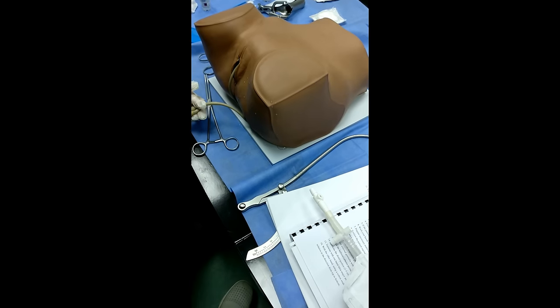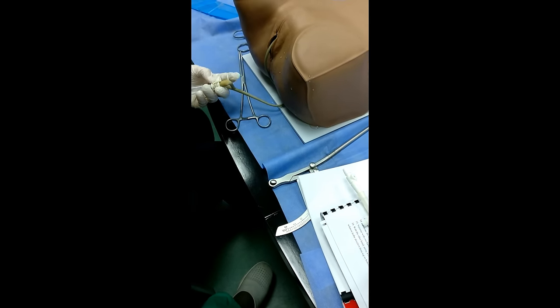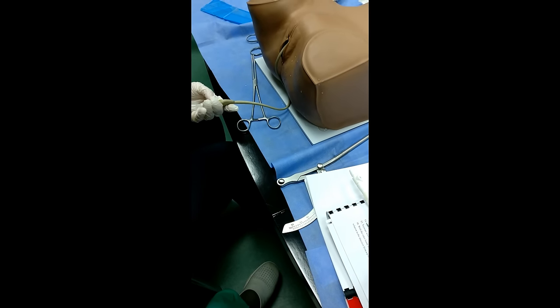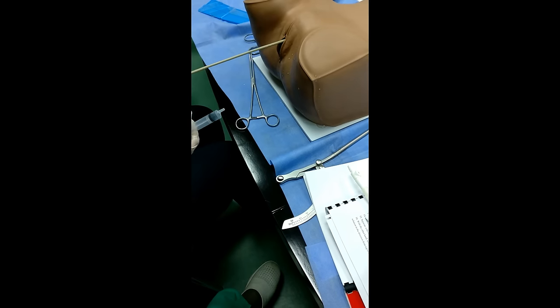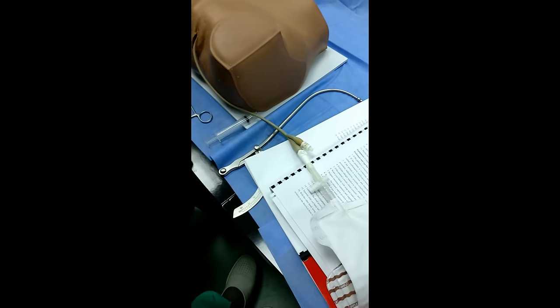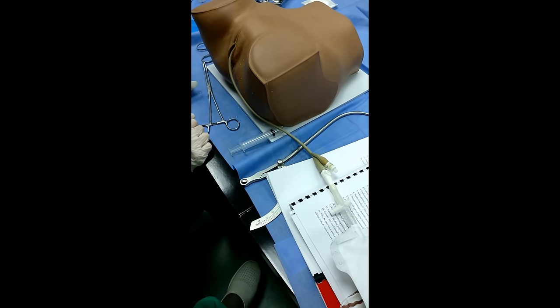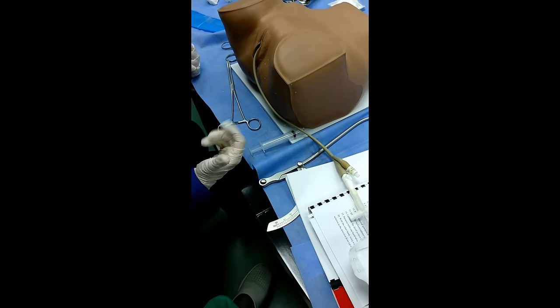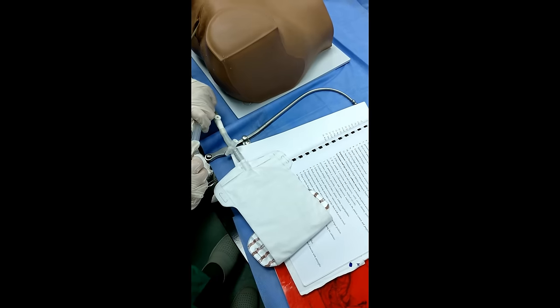We must inflate the catheter and adapt it to a collector. It's easy, but you know, our resident doctors don't know how to introduce a Foley catheter. Even a lot of doctors don't know.